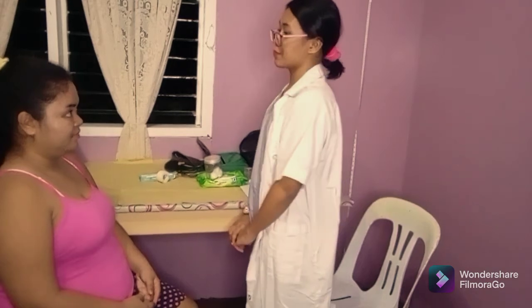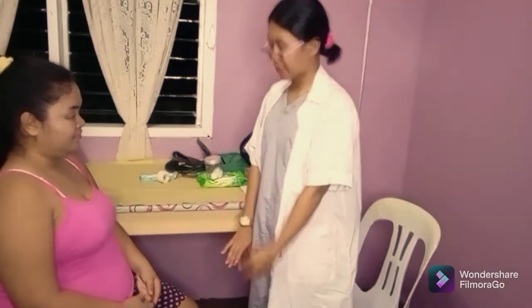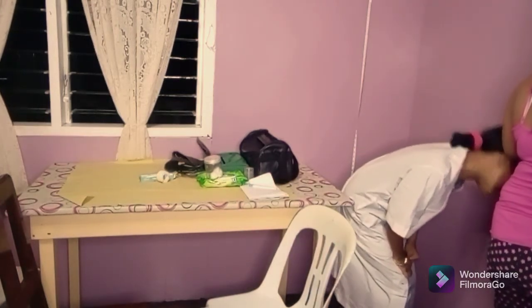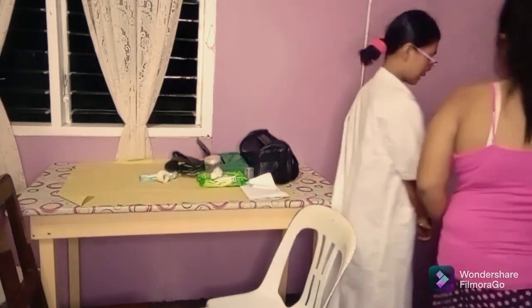So, at this point, we will be taking your body weight, and I want you to remove your slippers, please, as well as your accessories. I will now obtain your height and weight. You can go over here so that I can know your weight. Okay, ma'am, your weight is 70 kilograms.